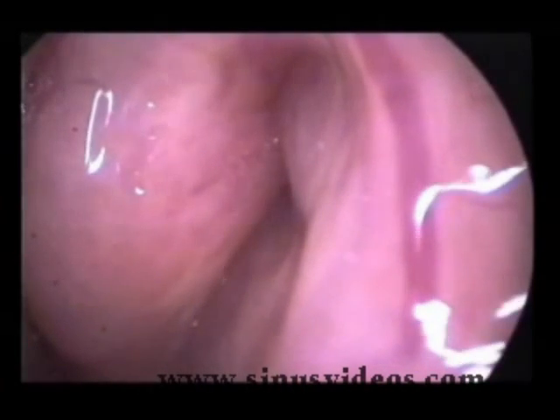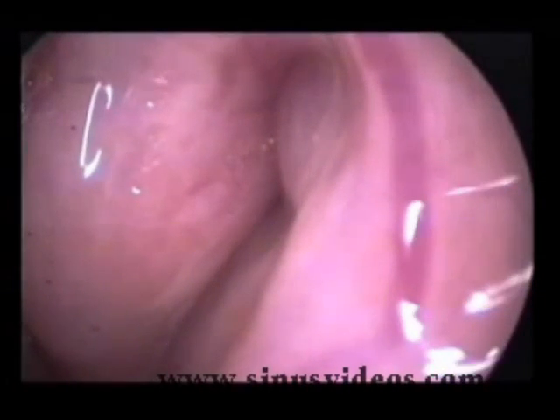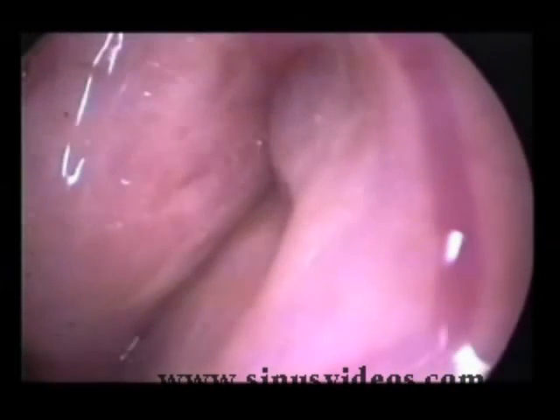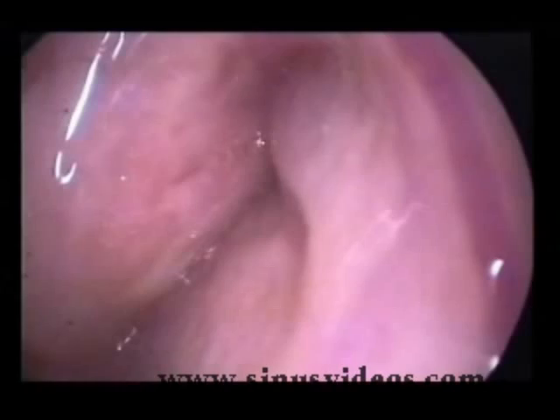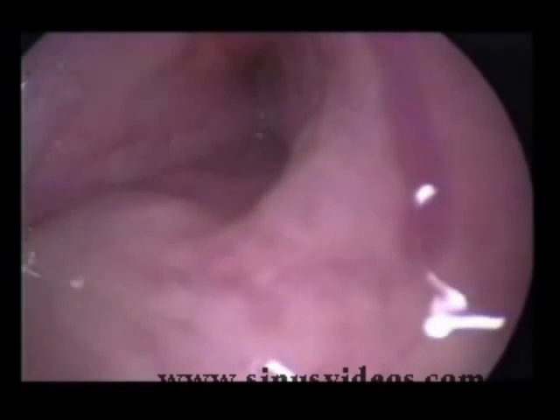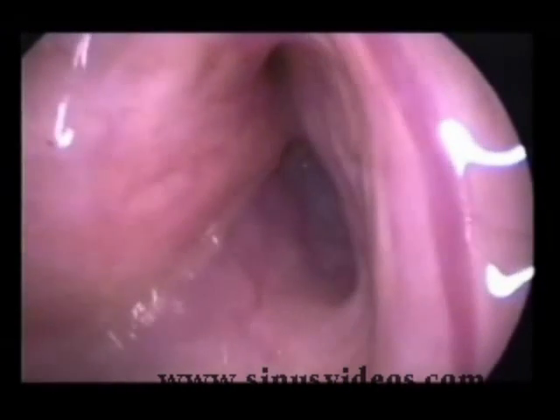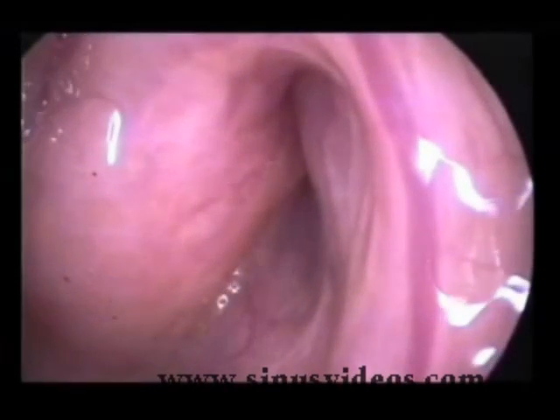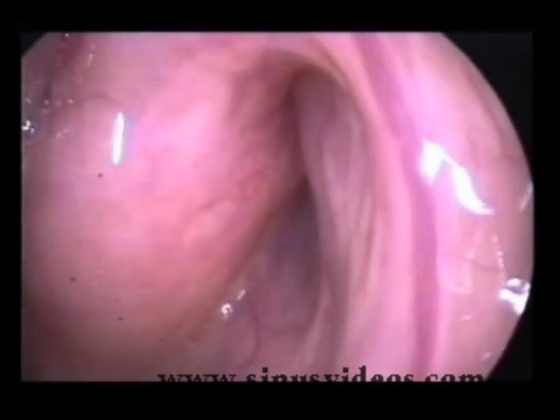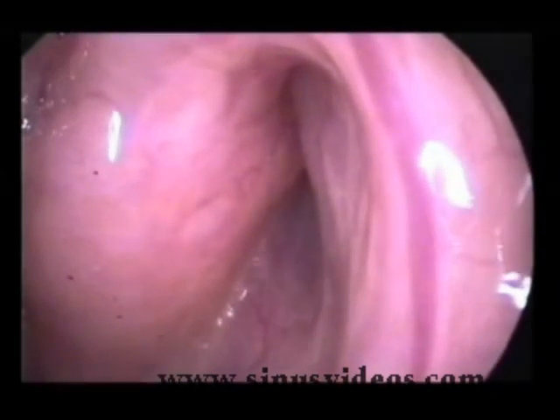Seen in very slow motion: initially the palate elevates and the lateral pharyngeal wall moves medially, then laterally, and then finally there is dilation of the tubal lumen, followed by rotation of the medial cartilaginous lamina or posterior wall.